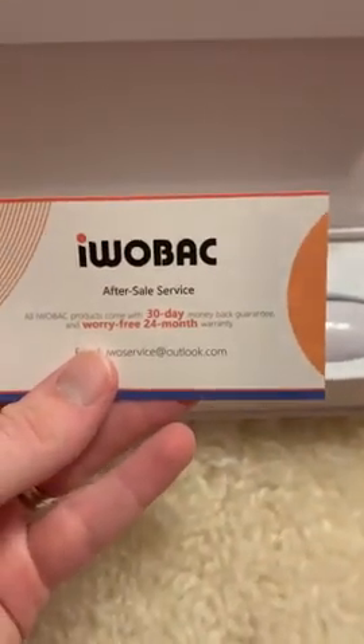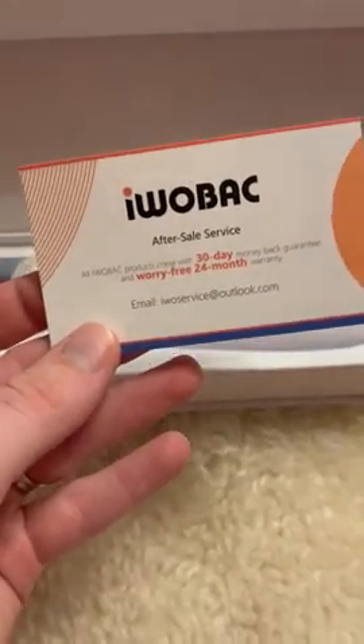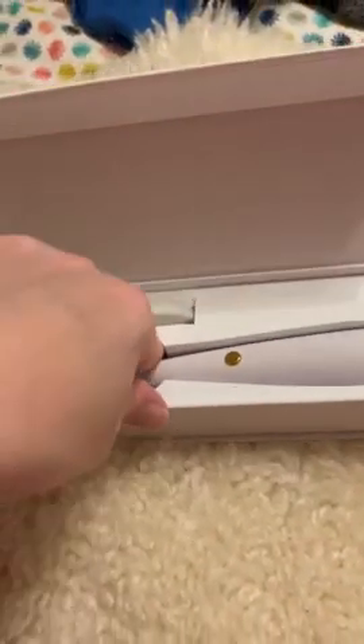Simple instructions inside. It comes with a nice warranty — 24 months — that's honestly one of the best warranties I've seen for medical-type equipment. I'm keeping it in the box for now.